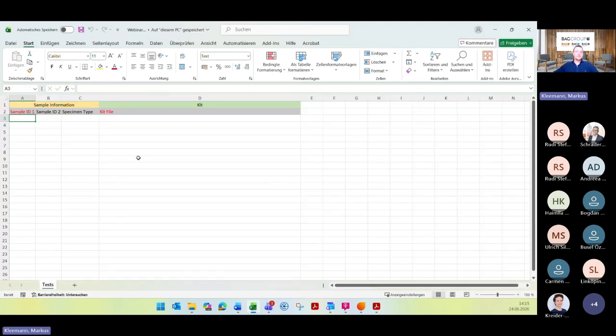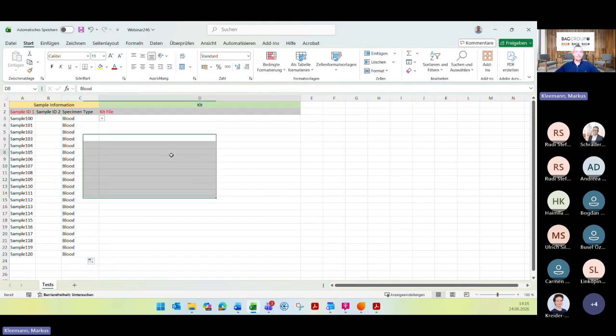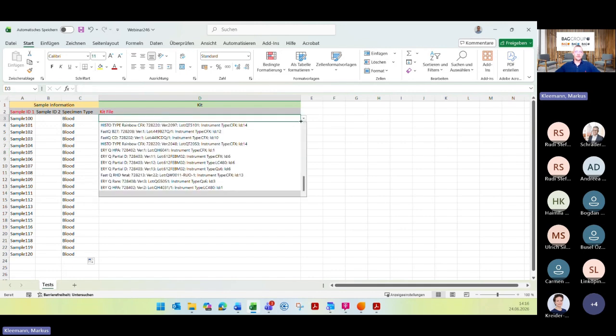And what you can see is just the basic table. So you have here the sample information and also the kit information. What you can do under sample ID again, which is here in red. So the sample ID and also the kit file again are important for PlexTyper. And what I now can do is create sample 100 again, and click here to move these samples down. And what you can see is that I create 20 samples in a few seconds, give them also a specimen type, blood in this case for the B27 direct, and choose the correct B27 kit file.